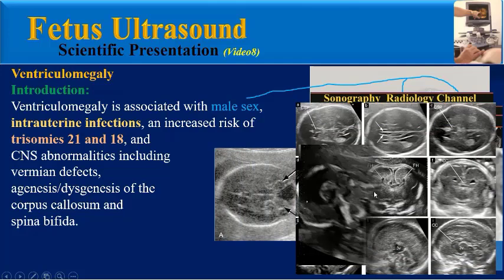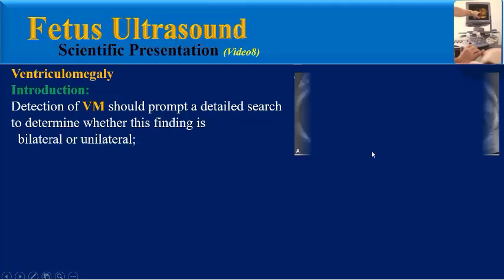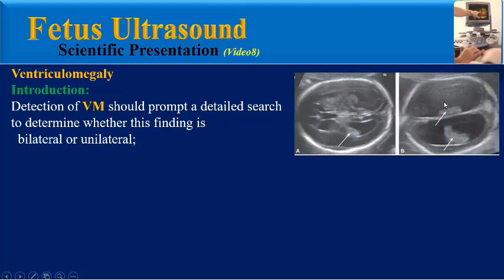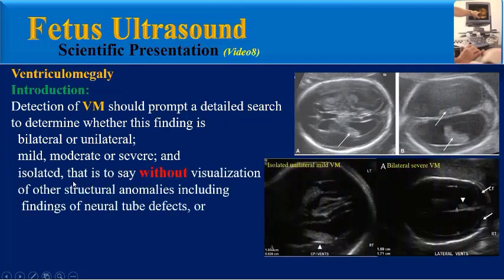Detection of ventriculomegaly should prompt a detailed search to determine whether the finding is bilateral or unilateral, mild, moderate or severe, and isolated — meaning without visualization of other structural anomalies including findings of neural tube defects — or non-isolated.